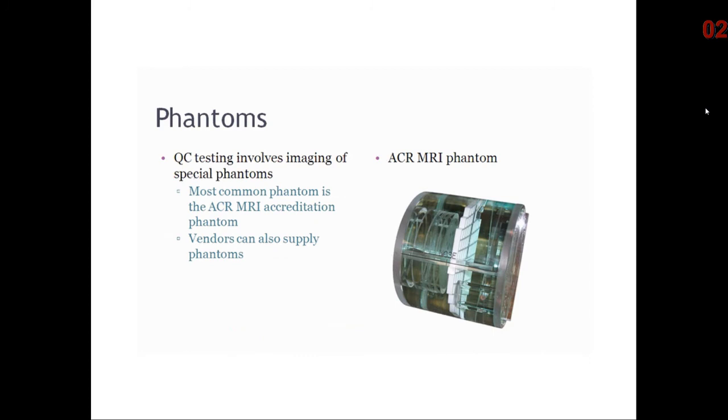Phantoms are supplied by your vendor, and there should be one to use with each RF coil, including the body coil. Every site should also have an ACR phantom to perform the weekly and annual ACR test. The ACR phantom, along with test protocols, are designed to perform and examine several important instrument parameters with a single phantom.